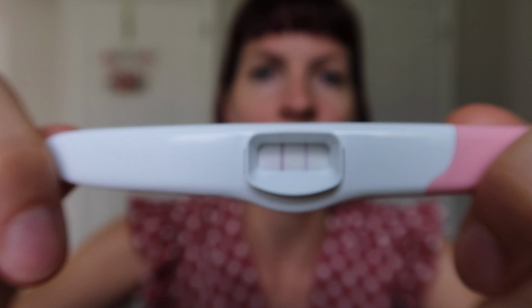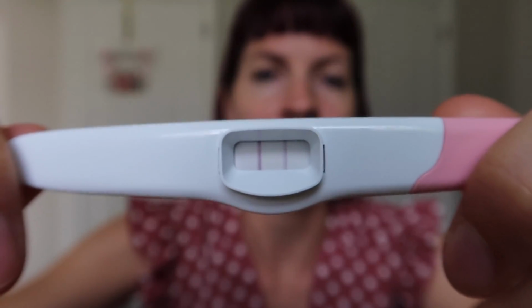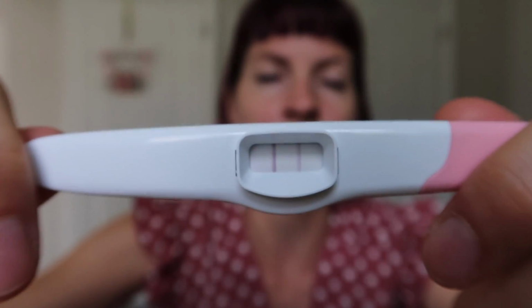And you pee on it for like 5 to 10 seconds, or you dip it in a cup of your urine, I should say. And then you cover it up, and then you take off this protection window. So here, I'll show you an old one I did. And then after 5 to 10 minutes, it's gonna show up. So basically, see how one of those is darker? That would mean that I am about to ovulate. There are some hormones that surge when your egg's about to come out.